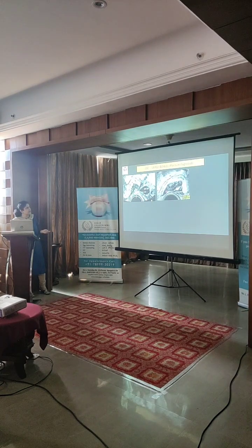Now this is another DIE lesion. You can see it's very large. The anterior muscularis is 10.7 millimeters, whereas the posterior muscularis is just 1.4 millimeters. And this is the typical signature of the bowel. So you have the anterior muscularis and posterior muscularis. Within the muscularis, you have this hyperechoic area, which is the submucosa, and right in the center is the lumen lined by the mucosa.